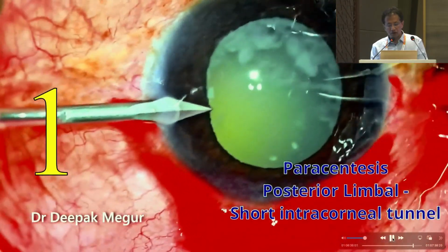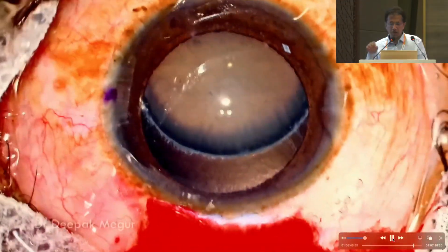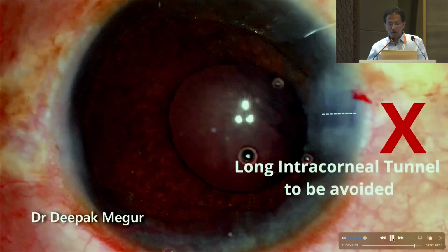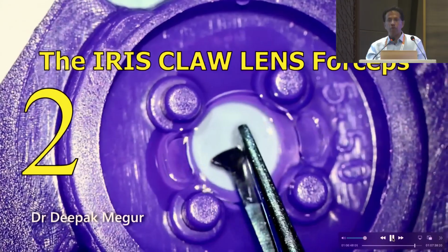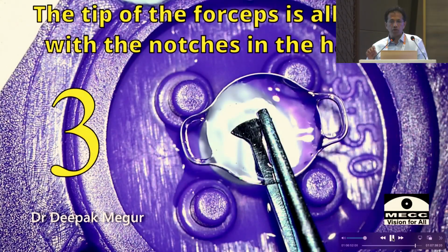That is, I learned it from Dr. Ravijit Singh. And you just have to make it as short as possible. You don't want a long tunnel. With a long tunnel, you can't reach the area where you want to enclavate. Use the appropriate forceps which has got the thinnest profile. That is very important because we don't want excessive corneal folds which hamper the visualization.